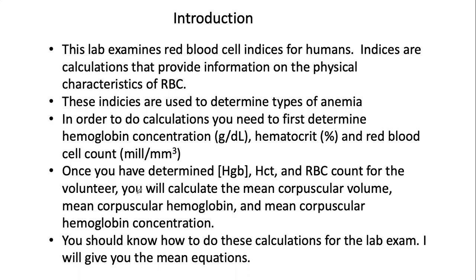What are indices? Indices are calculations that provide information on the physical characteristics of red blood cells. What are they used for? They're used to determine if someone suffers from various types of anemia.